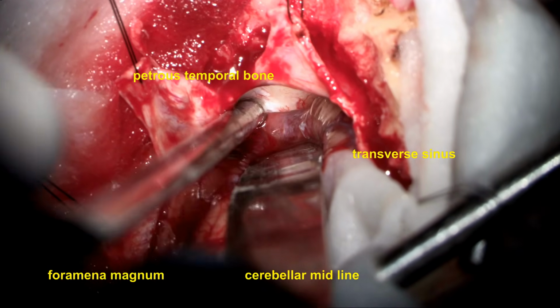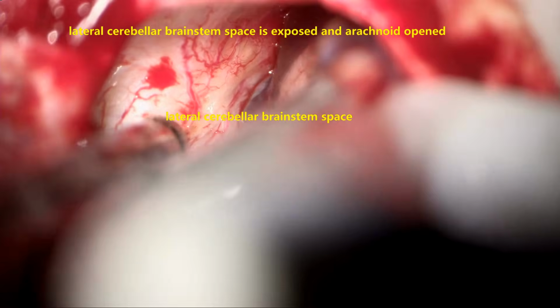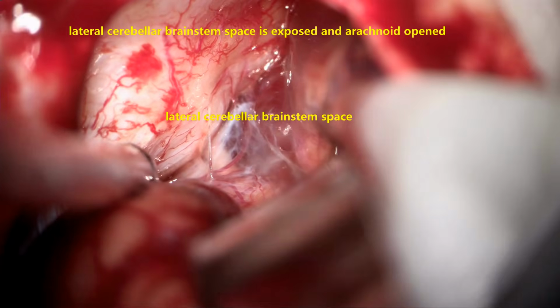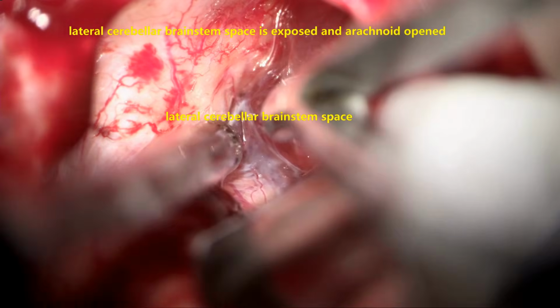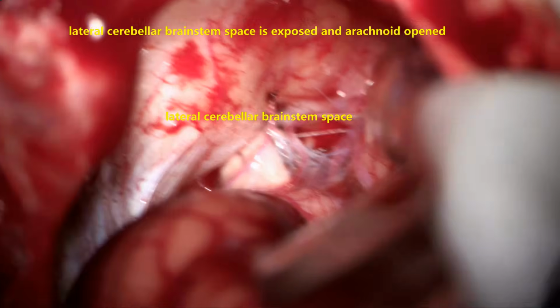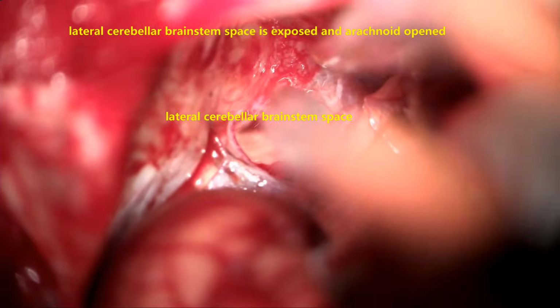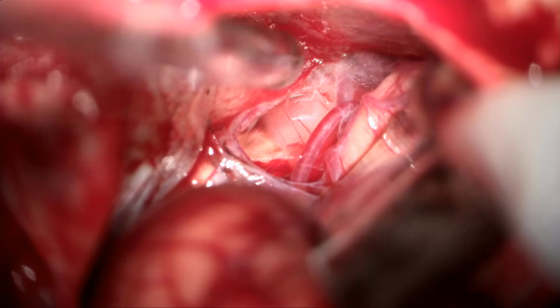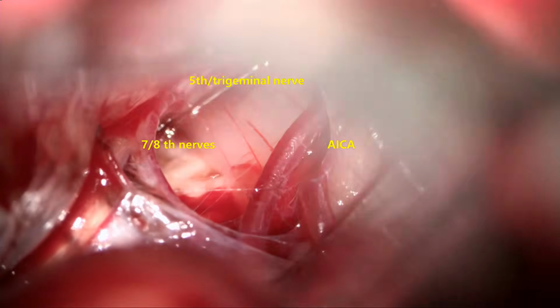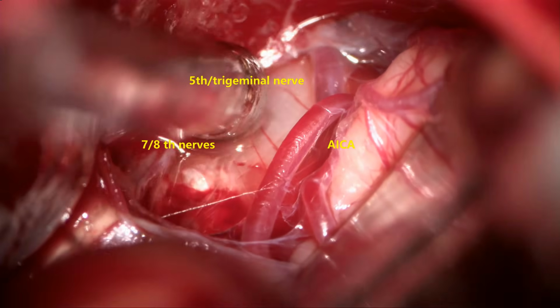Once that is done, the dura is opened in a cruciate fashion and gently the cerebellum is retracted. Now the lateral cerebello-brainstem space is exposed. The next important step is to open the arachnoid of the space and expose. Unless we open the arachnoid, we cannot reach these areas and excise the lesions.